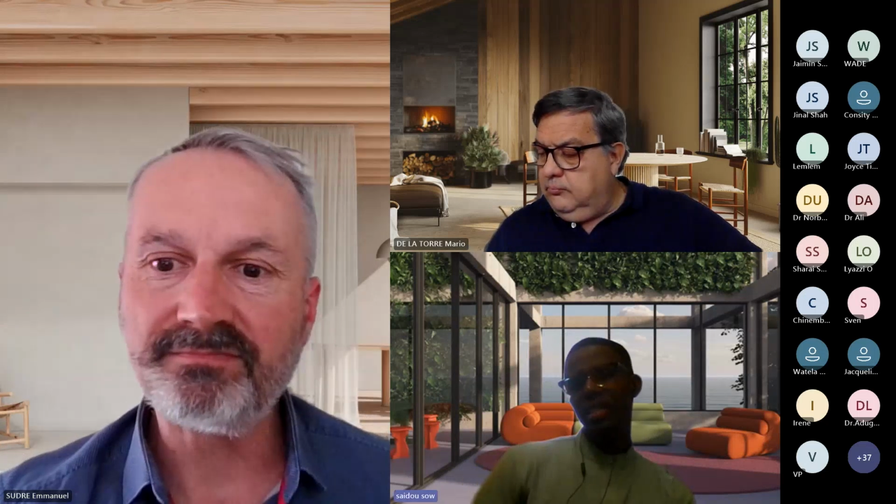Okay. After SLT, what I can say is that we don't systematically stop the eye drops. It depends on whether we reach the IOP target that we aim for; if so, we can stop. But what is important is the follow-up. We can't stop the treatment and let the patient go. We need to see the patient again and again to check that the IOP is still normal and not increasing.